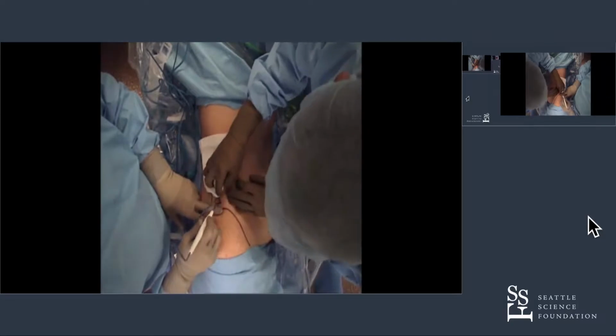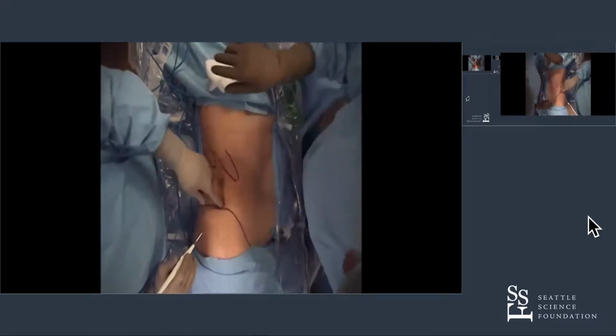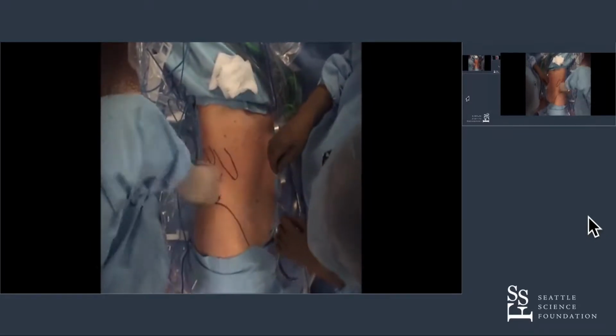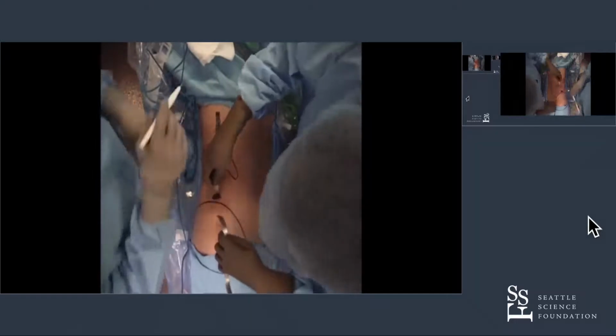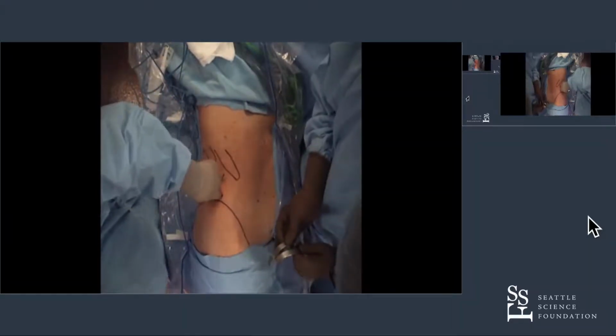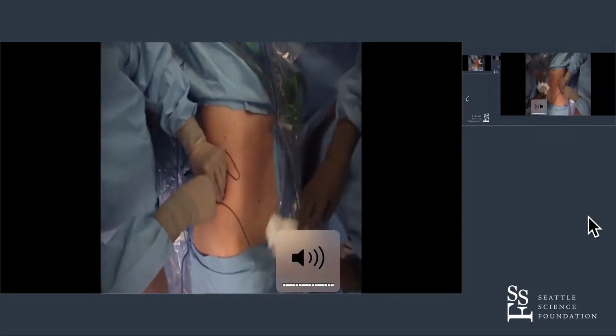So he's going to make his incision there, and you don't want to make this incision too big either, because you don't want it to leak. So just make it the size of your finger. Jim's got big fingers, so it's probably a big incision. So you can see here, he's just getting through the initial layer down to the fascial layer, and then he's going to pop through with a tonsil. You can use a tonsil, a Kelly, a hemostat, whatever you want, but it is tough enough that you're not going to get your finger through it.